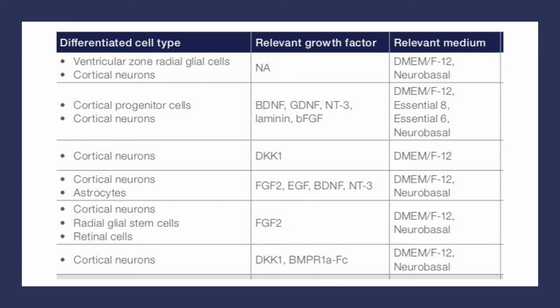Now, all these cells are grown in culture on a dish. They do not represent tissue. You can study the cells, you can study the behavior of the cells, but you cannot really study how they function as a tissue, as a coordinated tissue. So there's a lot of research going into the development of what are called organoid cultures. And we have a few groups here in our department, also in the pharmacy department, that are working on developing organoid cultures, because organoid cultures are cultures that may more clearly represent tissue, specific tissue. I'll give you an example in the next one.